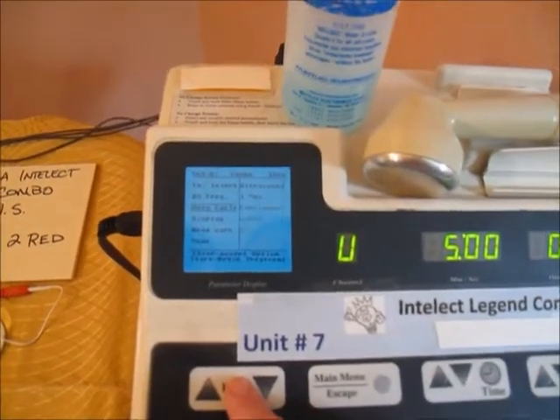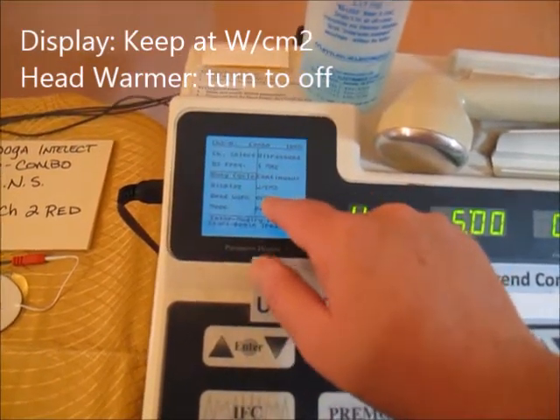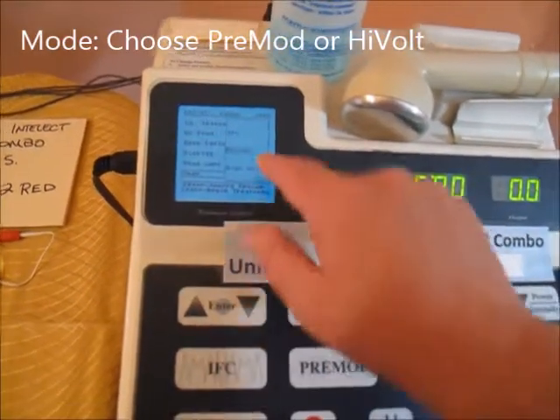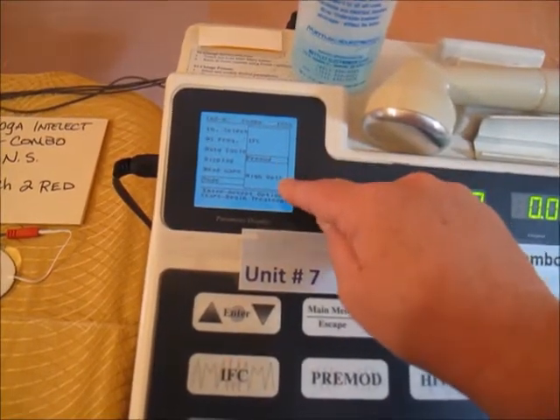Keep the display in watts per centimeter squared, head warmer off, then go down to mode. It's preset to pre-modulated. The other options are high volt and IFC, but the only two we'll use are pre-mod and high volt.